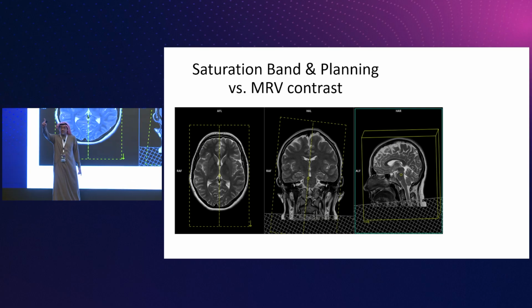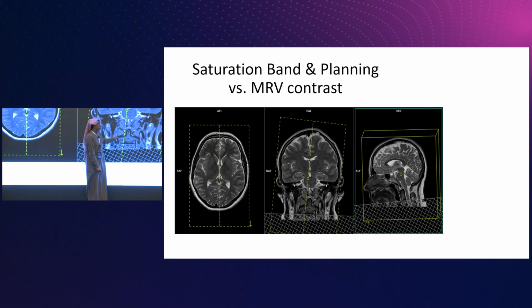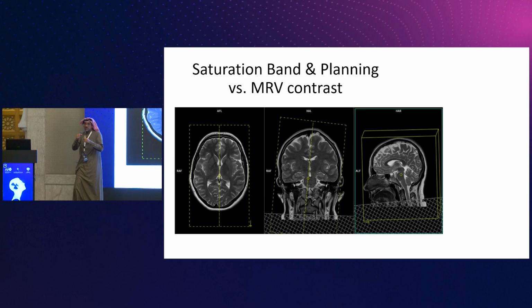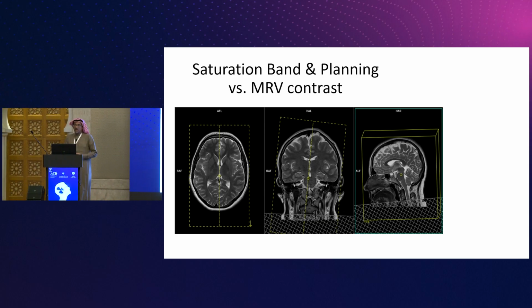And by the way, see here, just watch this. The angle this way, and axial the other direction. To maximize that, you have fresh blood coming and exciting fresh blood. Try it tomorrow.